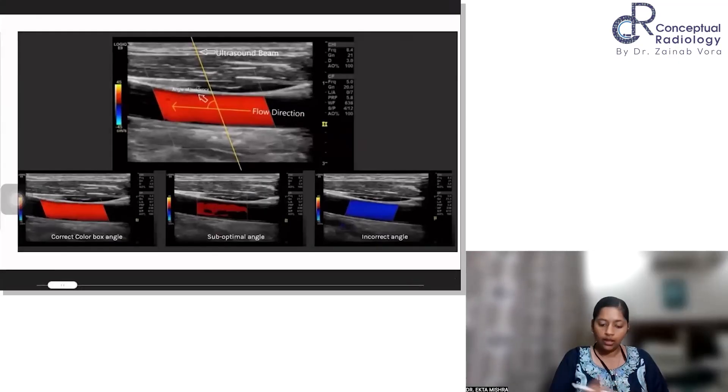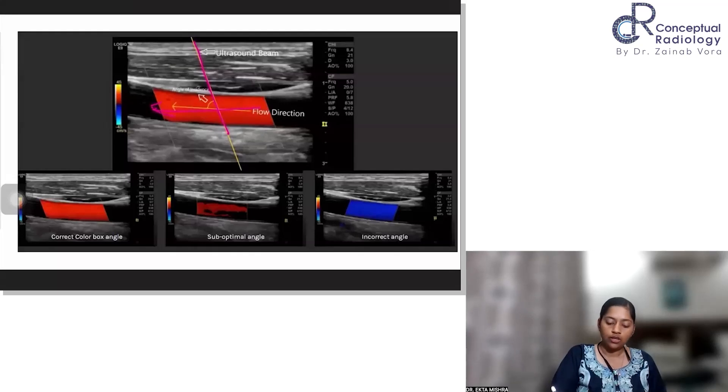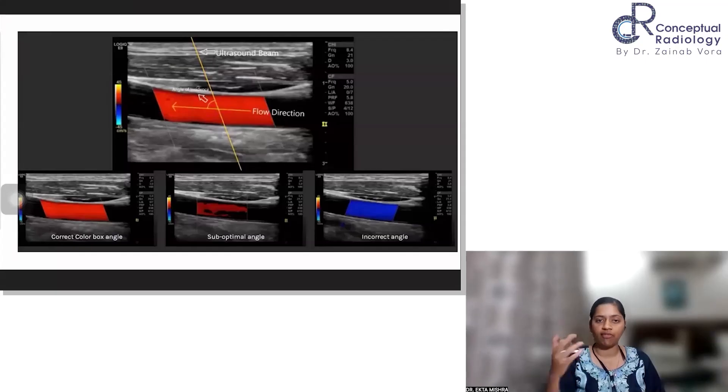This was for curvilinear. For linear probes, see this is the ultrasound beam and this is the direction of flow. So the angle between them is the Doppler angle. So what you can do is you can adjust this angle by two things. First is you can adjust the angle by angle correction. That will come into play once you're steering and everything has been done and still you want to optimize the flow. So when the color box angle is correct, you get complete filling of the vessel.